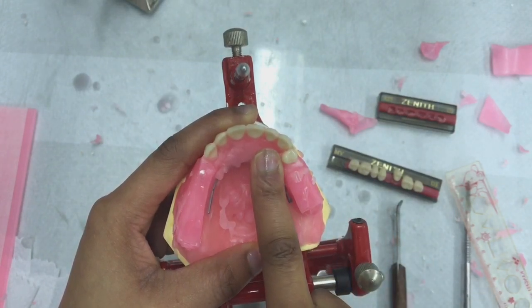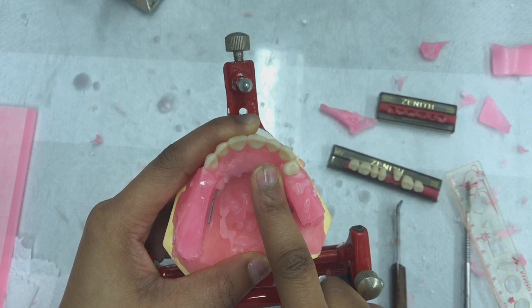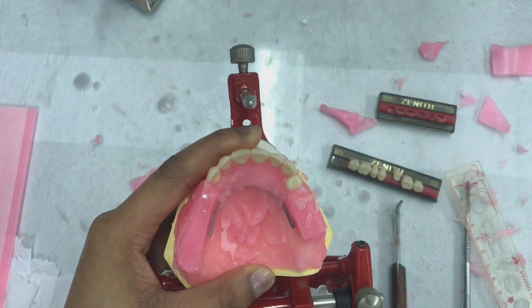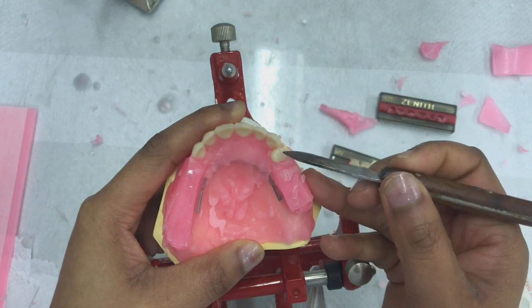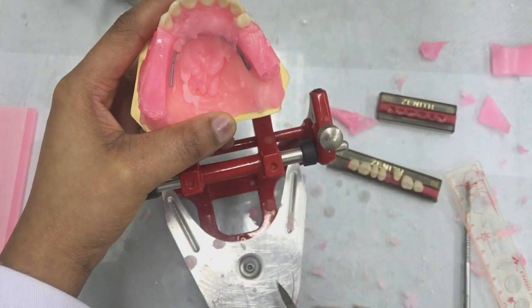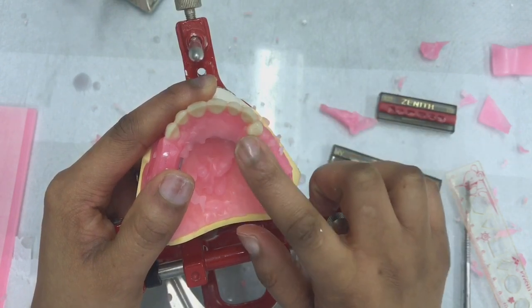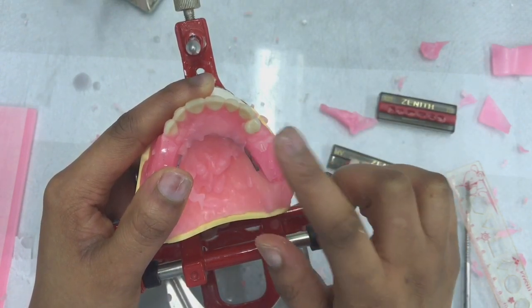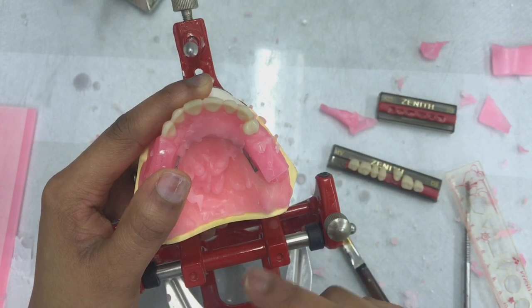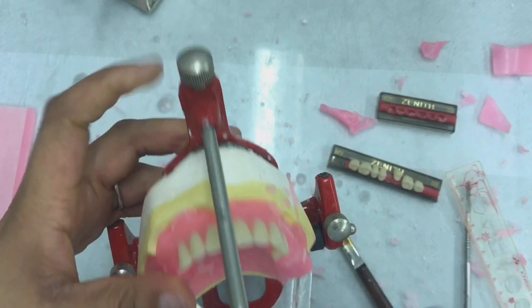In addition to placing your premolar in this location, the first premolar lingual cusp must be off the occlusal table by 0.5 millimeter. So the buccal cusp sits on the occlusal table, and then the lingual cusp must be off the occlusal table. Since I'm happy with my position, I'm going to try by all means not to move my premolar from this position, but as I tweak the tooth to get the lingual cusp off the occlusal table, I will again check if the positioning of my premolar is still in the desired position.